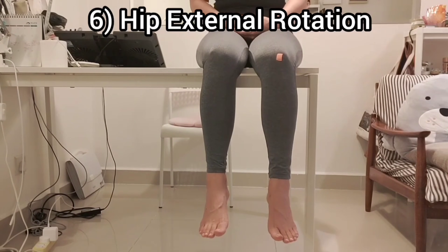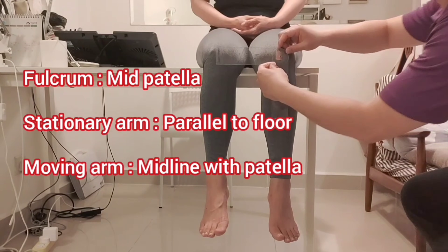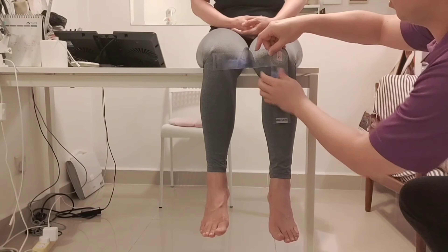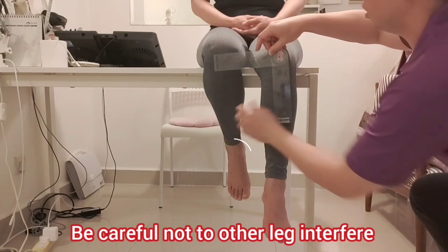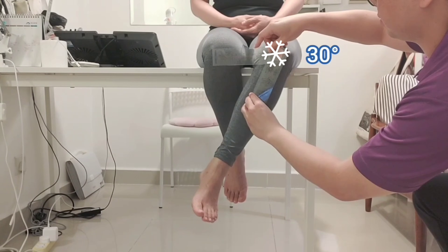Number six: hip external rotation. The fulcrum, stationary arm, and moving arm are the same as for internal rotation of the hip. One thing to be careful of is ensuring the other leg does not interfere with the externally rotating left leg.